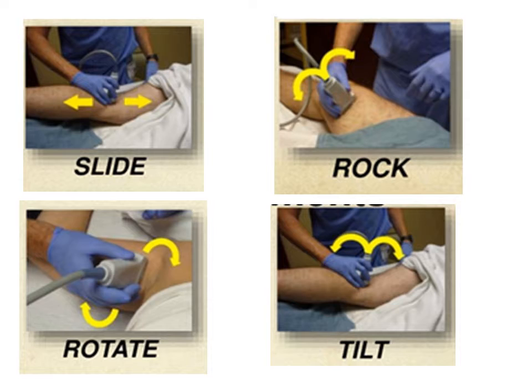So sliding is moving the whole probe so that the footprint of the probe changes and it moves up and down the chest, for example, or medial to lateral, for example. The other thing is rocking the probe. Here you just tilt the probe medially or laterally, and the footprint doesn't change much. Just a slight tilt is given medially or laterally.